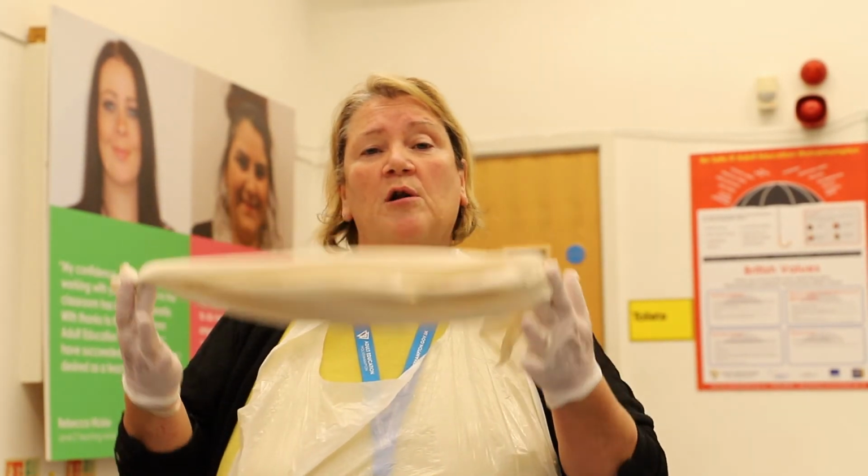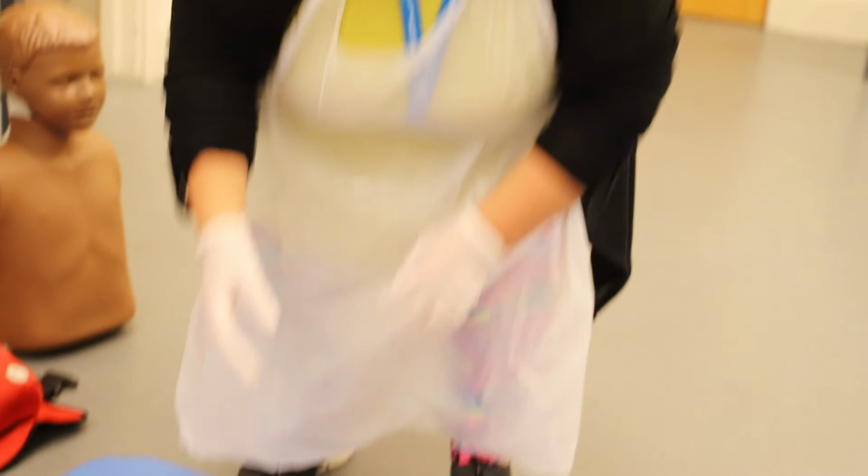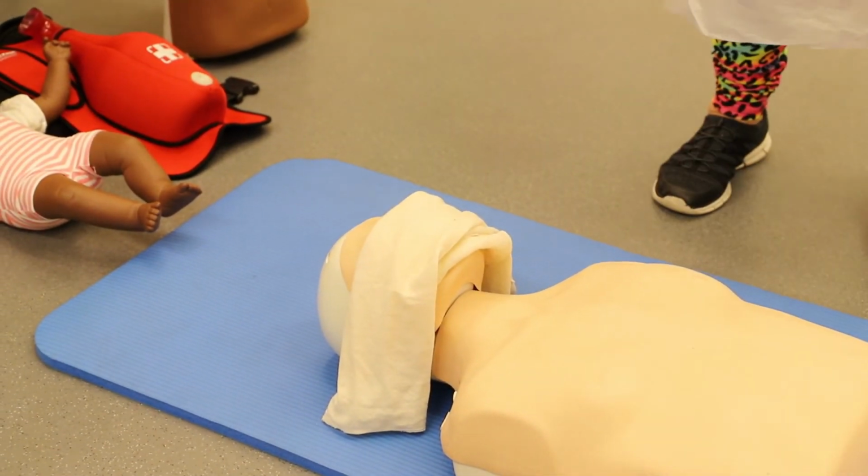Okay, so when dealing with a casualty who's potentially not breathing, we're unfamiliar with our casualty and they may have COVID, what we need to do is make sure that we protect ourselves and also our casualty. So we need to get a cloth, it could be a tea towel or anything like that. We need to put it over their mouth and nose, like so. Okay? So, we still need to be checking for danger.